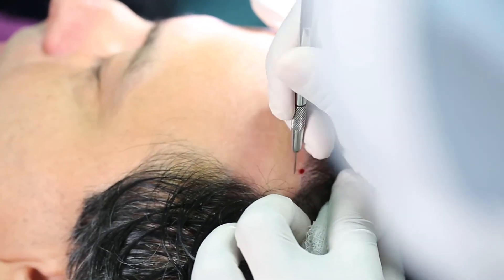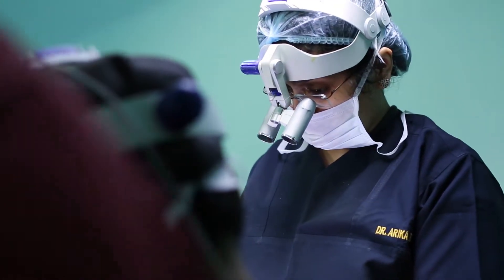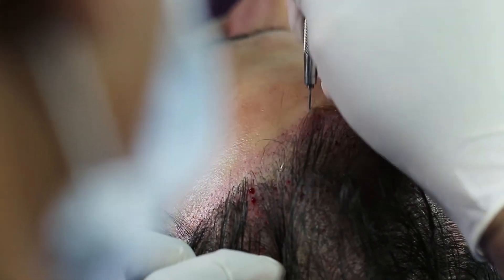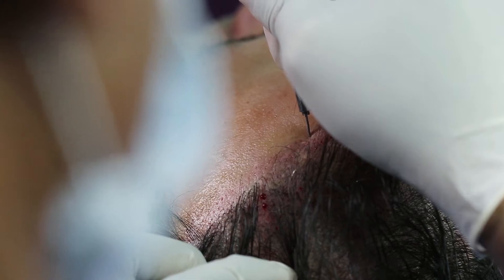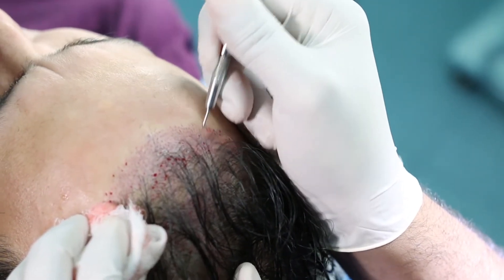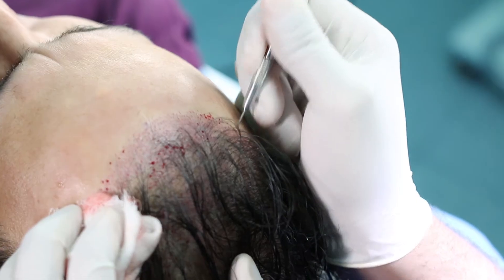In the DHT technique, first we make the sites in the recipient area under Carl Z's loops in proper angle, depth, and density. Since the sites are pre-made, the extracted grafts can be implanted as soon as they are harvested. This ensures the least out-of-body time for the grafts.